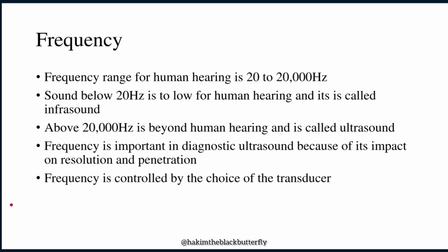So you cannot use a high frequency when you are scanning an obese patient. If the patient is huge, with a lot of fat, that means the beam has to go through fat first before it even reaches the organs that you need to look at. So you can't use a high frequency on a fat patient. You use low frequency because that has the ability to penetrate and reach those organs. But if it's a small person like me, even my abdominal organs can be seen by high frequency. I don't know, but that's what I'm assuming. So that's the importance of frequency in ultrasonography.